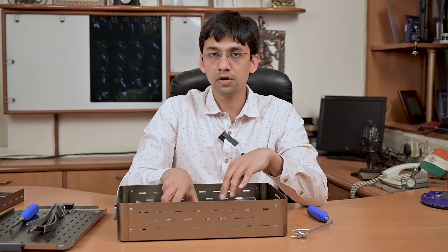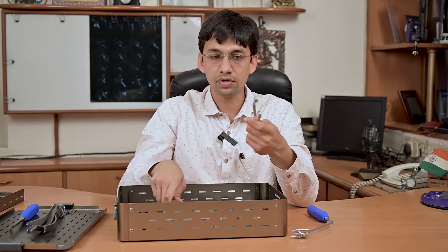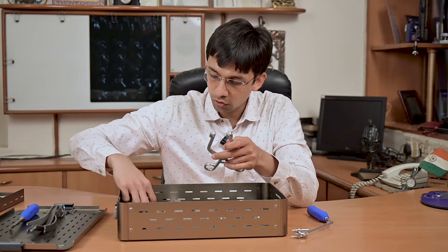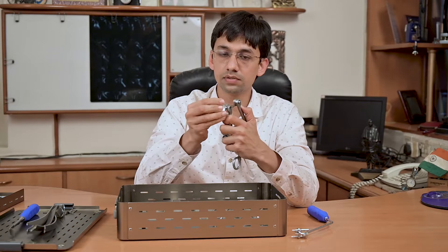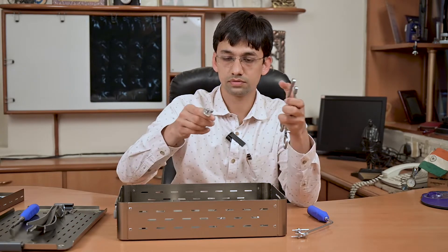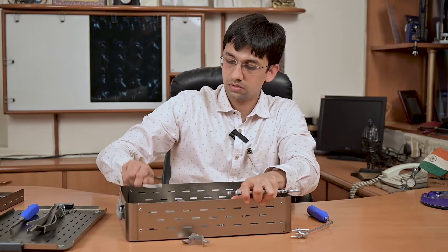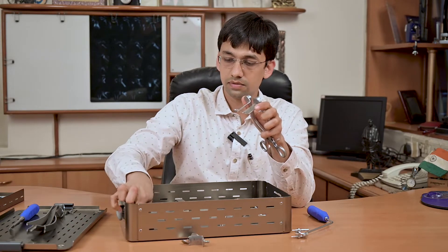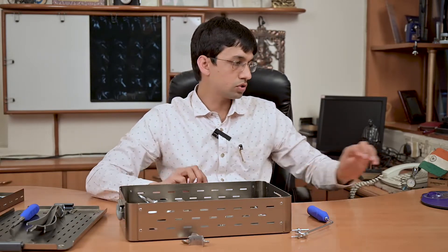We have patients of different sizes with different muscle bulk, so we have the universal shoulder retractor, which has different sizes of blades that are easily attachable and detachable — the smallest, medium, and large sizes. That covers all the instruments; now let's talk about the screw.